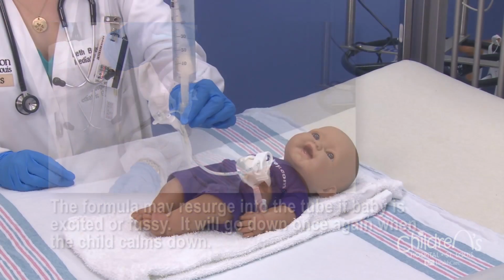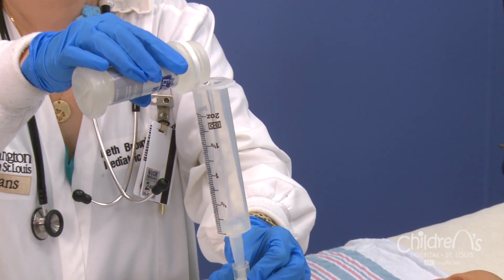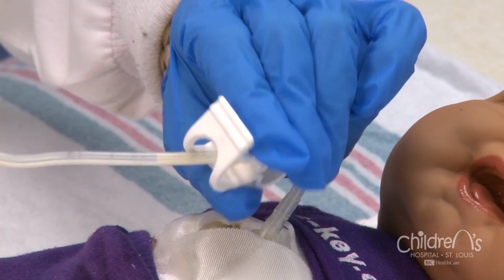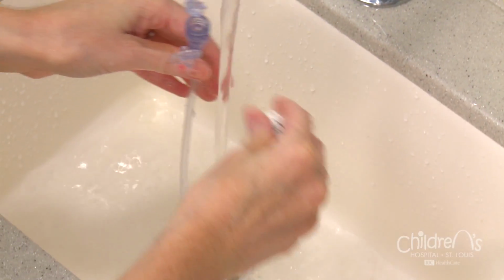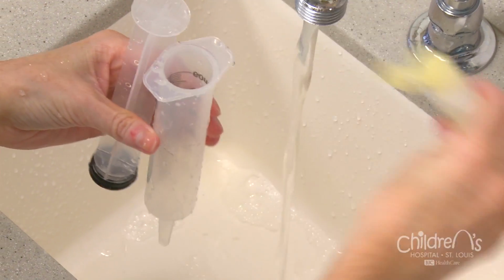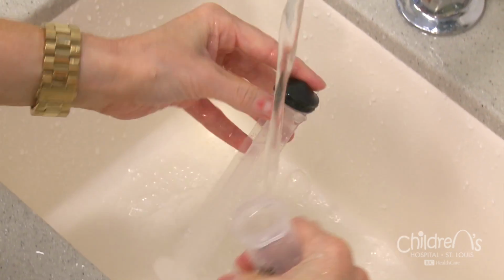When the feeding is complete, flush the tubing with 5 to 10 milliliters of water. Clamp the tube, then disconnect the syringe and replace the cap, and if needed, the rubber band. Wash supplies with soap and water. Rinse and allow to air dry. You may reuse your supplies, so you want to make sure they're clean and ready for the next feeding.